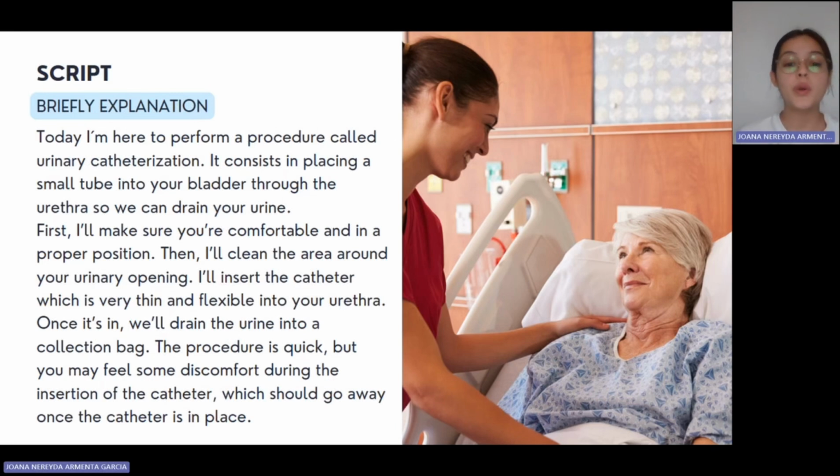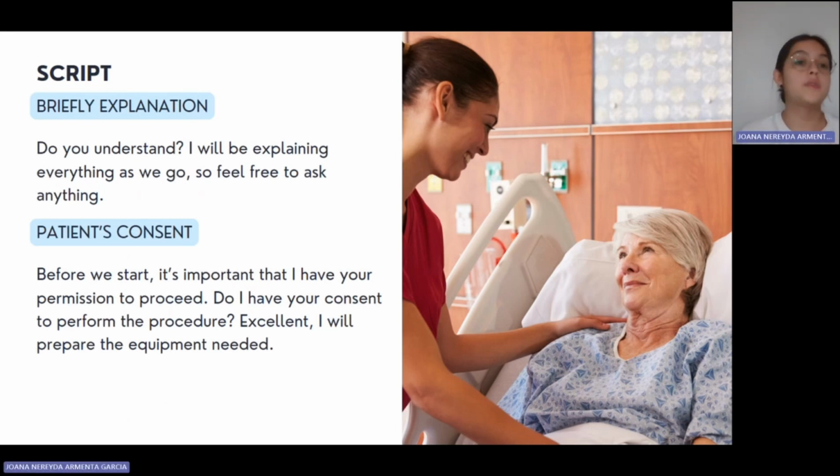The procedure is quick, but you may feel some discomfort during the insertion of the catheter, which should go away once the catheter is properly placed. Do you understand what I just said to you? I will be explaining everything as we go, so feel free to ask anything.